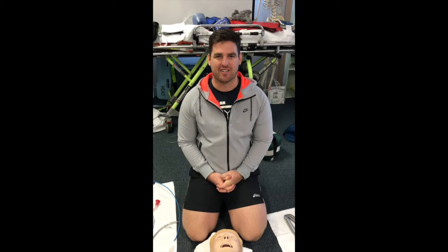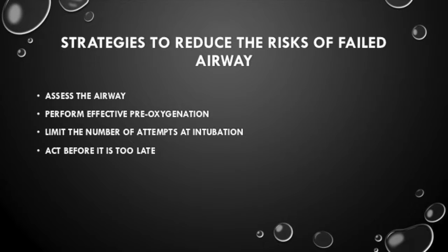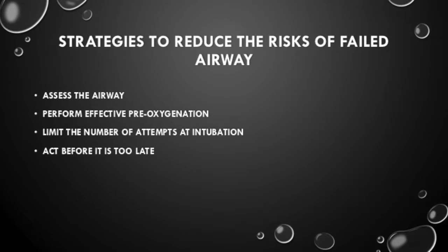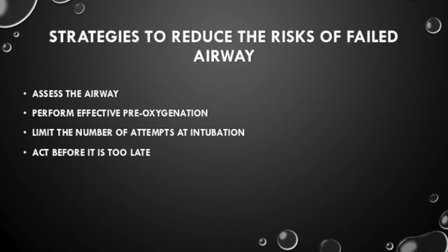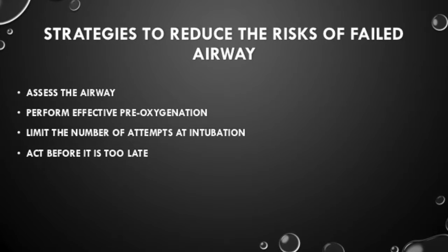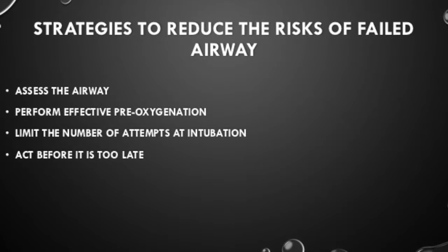Hi, I'm Matt Collins, and today I'm going to be demonstrating the failed intubation drill. Some strategies to help reduce the risk of failed airway include assessment of the airway, effective pre-oxygenation, reducing the number of attempts at intubation, and acting before it's too late. And prepare the patient as best as possible.